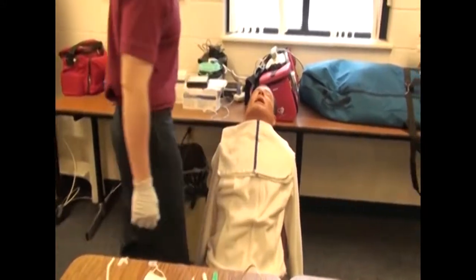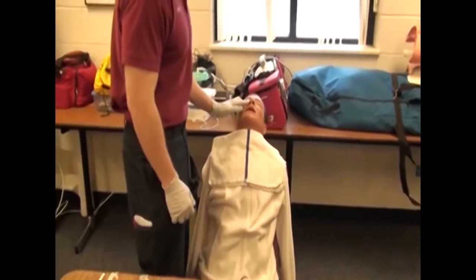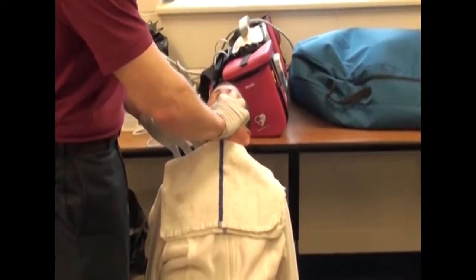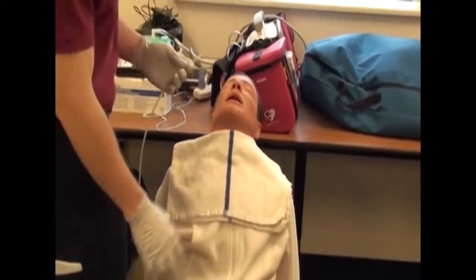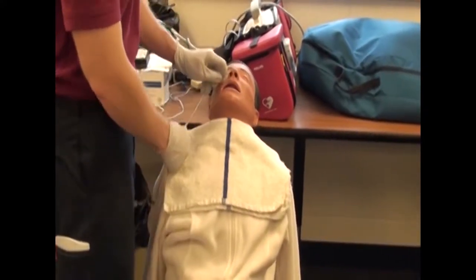Give facial tissues to client. Instruct client to relax and breathe normally while occluding one nares. Repeat with other nares. Select nares with greater airflow. Measure distance of insertion by placing tip of tube at client's nose and extending tube to tip of the earlobe and then down to the xiphoid process.